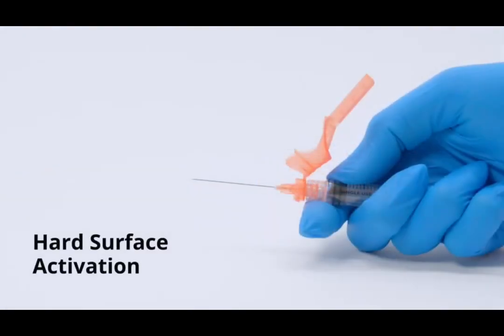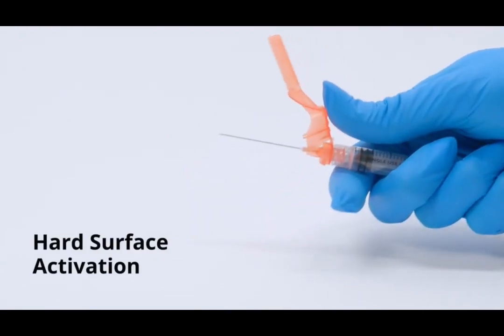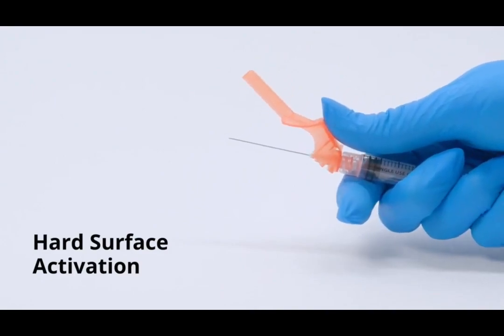Hard surface activation. Push the tab forward with your finger or thumb so that the sheath is less than 90 degrees from the needle.